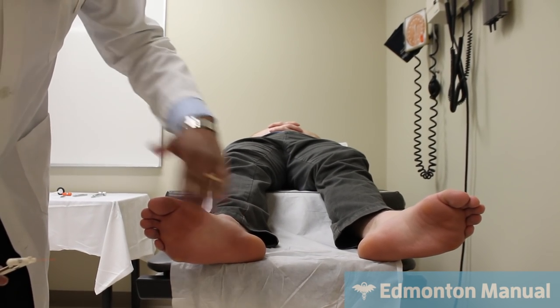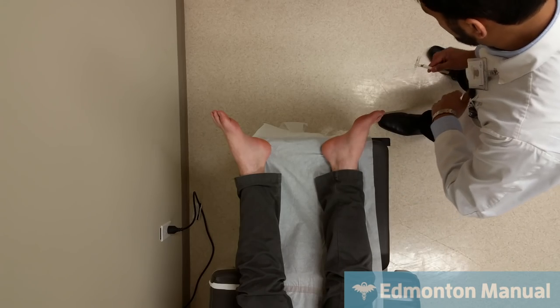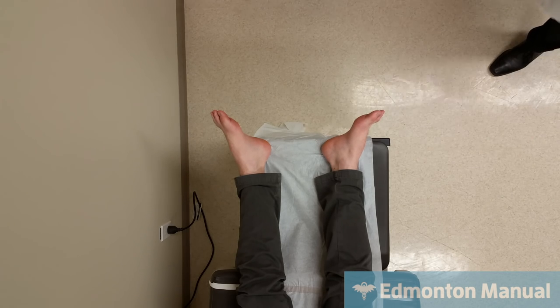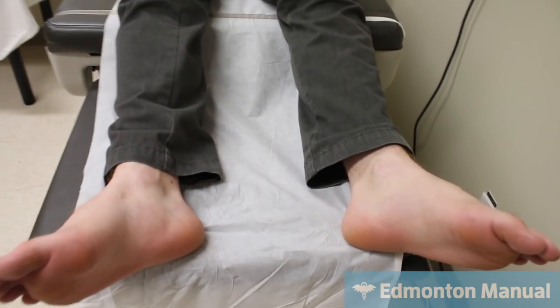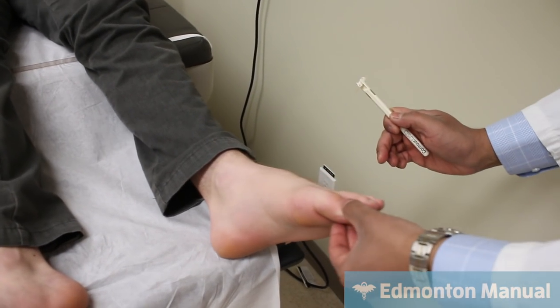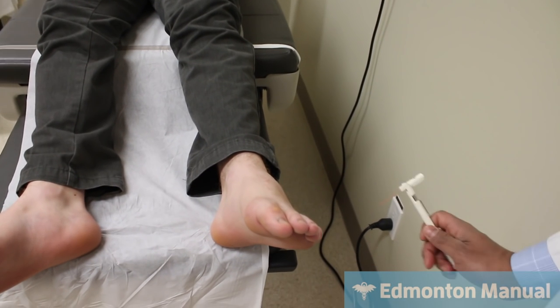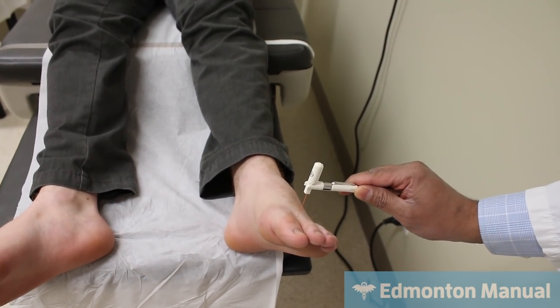Now, old Canadian guidelines used to say to do 9 here, but the newer ones have actually changed. So what we're now going to do is I'm actually going to test on the dorsal aspect of the foot. And so what some of the newer Canadian guidelines suggest is actually just testing on the distal phalanx of the great toe, or the big toe, and just testing in this one area.